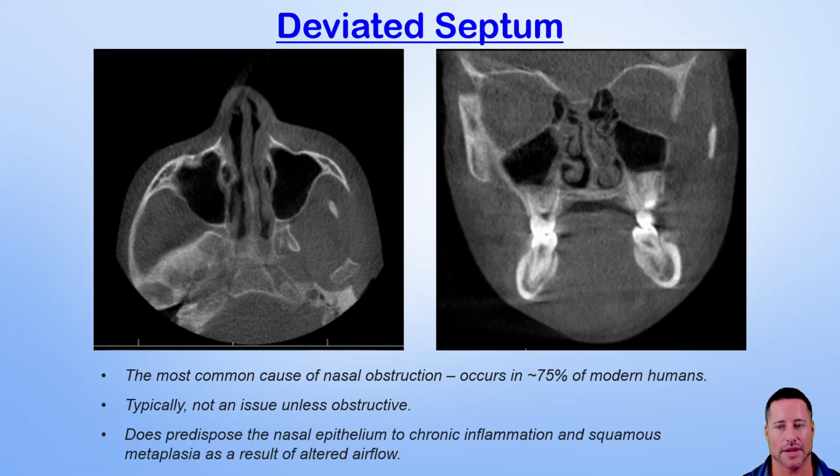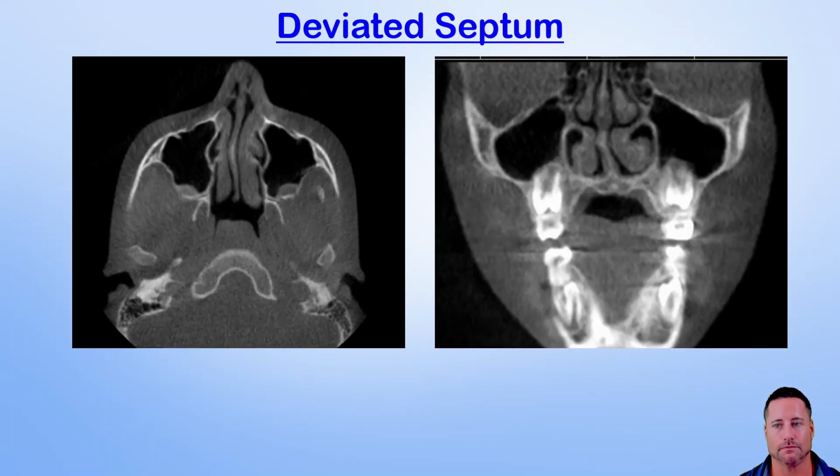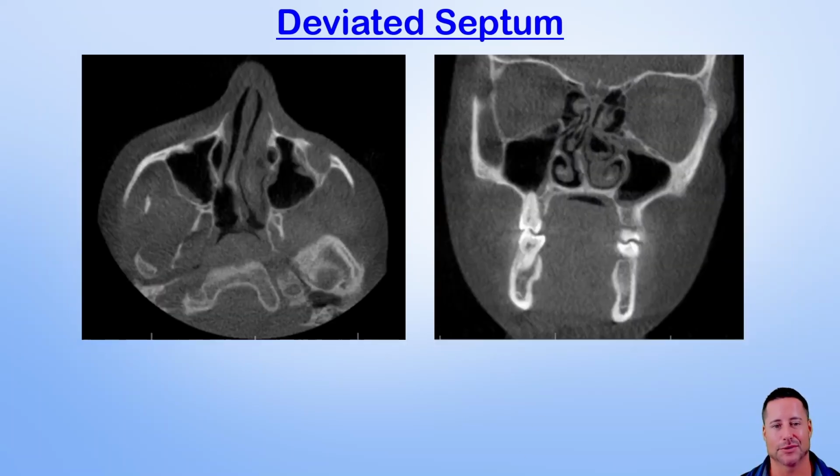And in this particular patient, I did refer because he said that he chronically can't breathe out of the left side of his nose. So that's something that the ENT and or allergist should be taking a look at. Here you can see the deviation over to the patient's right. And again, here's that deviation of that septum. Once again, if I go back and look, you can see the tongue posture, vault of the palate, all those cool things we can see, and another deviation of that septum there.